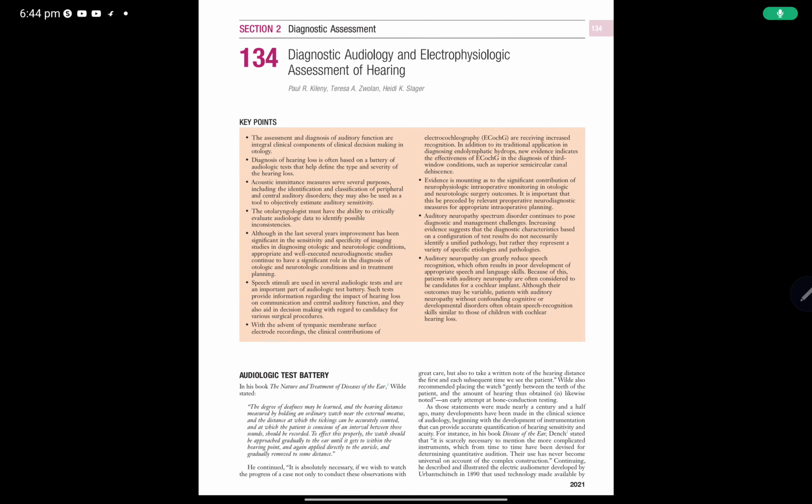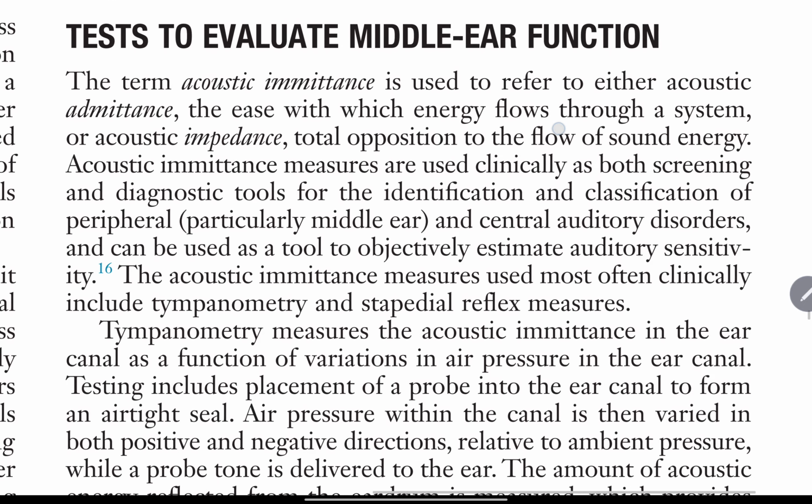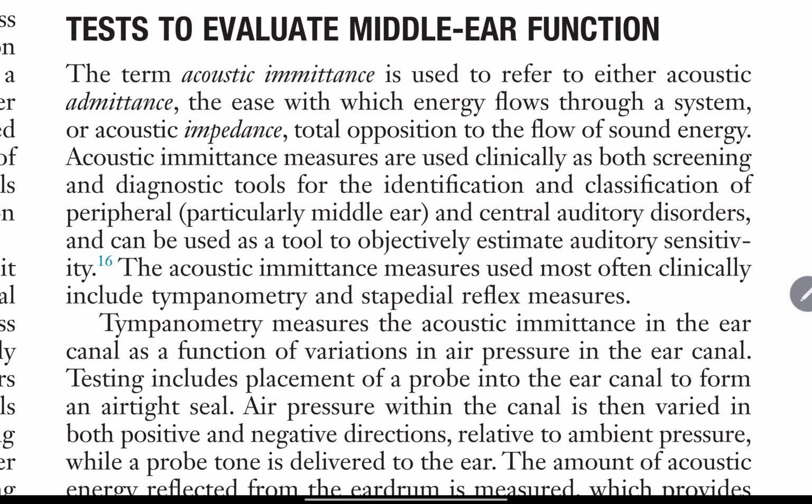Cummings Audiology, Section 2, Diagnostic Assessment, Chapter 134, Diagnostic Audiology and Electrophysiologic Assessment of Hearing. Tests to evaluate middle ear function.